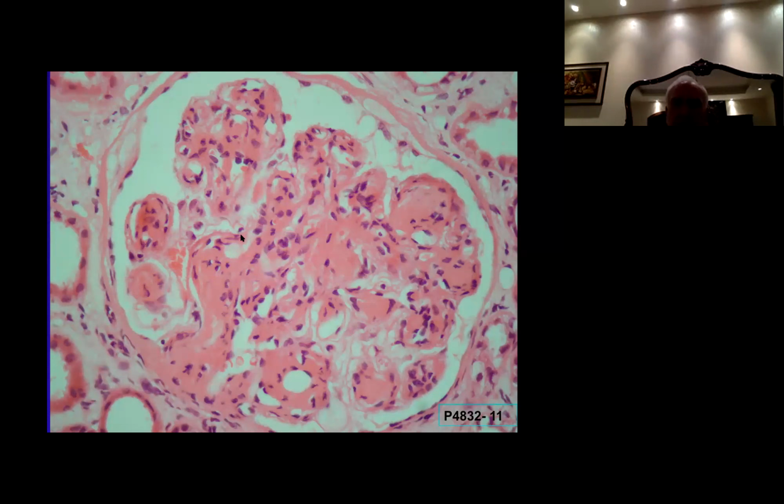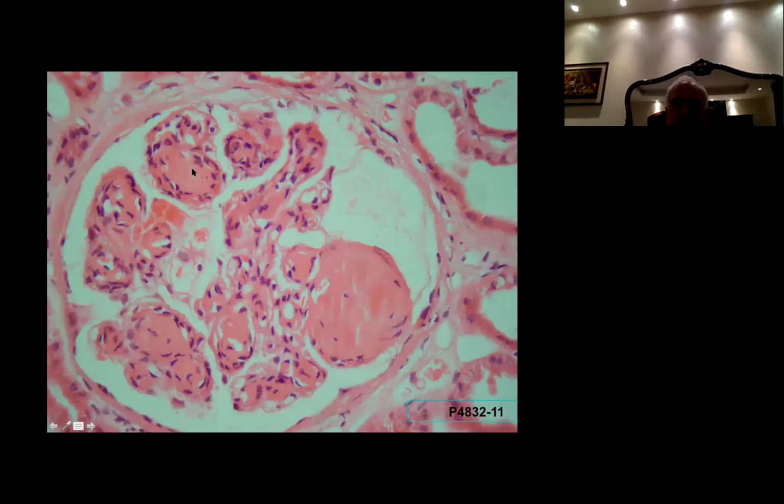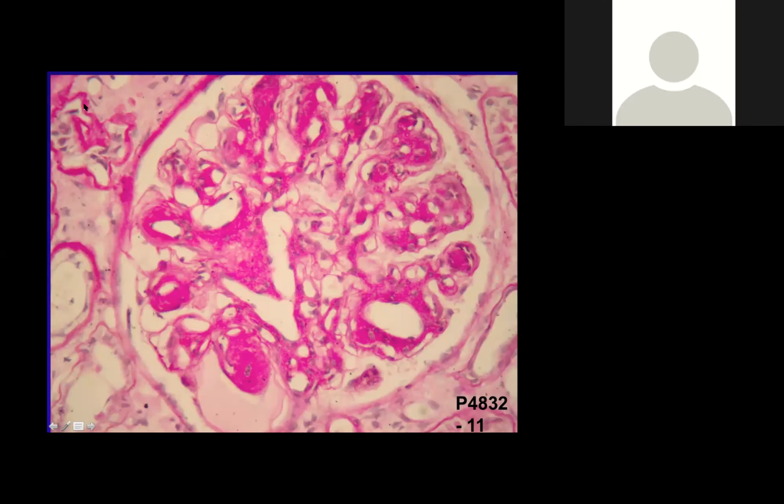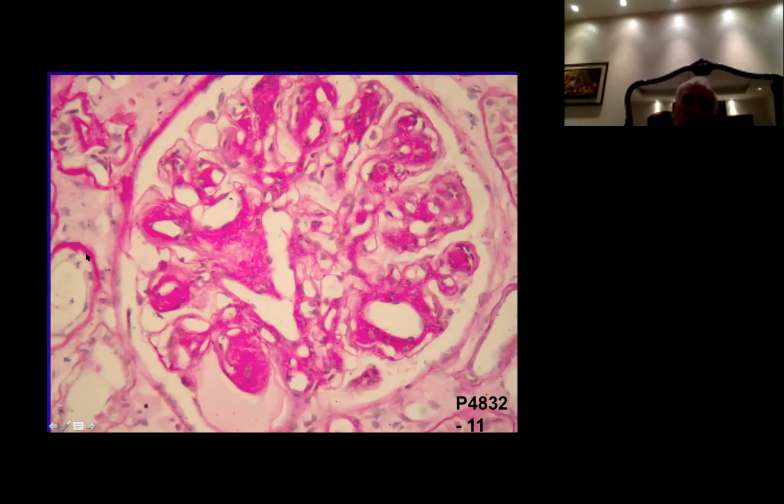Talk about this nodule. Now, PAS stain, this material, when you see this, it's quite pink. It's not really amyloid. Amyloid will be faint looking. Amyloid will not stain the Bowman's capsule. The tubules also stain, the renal tubules. All this, the renal tubules, the Bowman's capsule, with this kind of stain, with this pattern, that's not amyloid. This is deposit disease, light chain deposit disease.